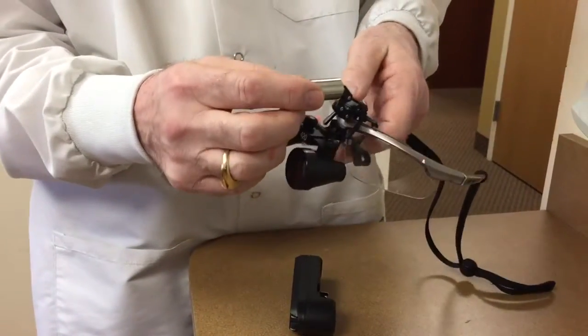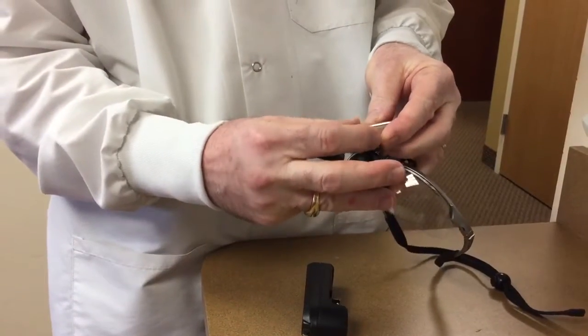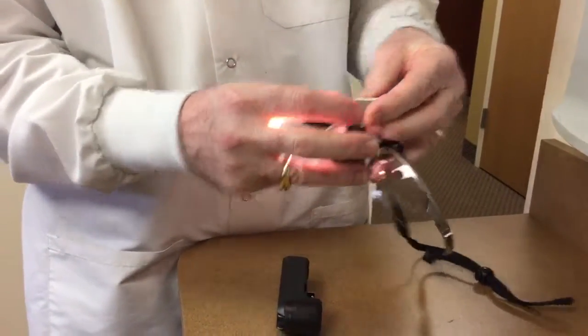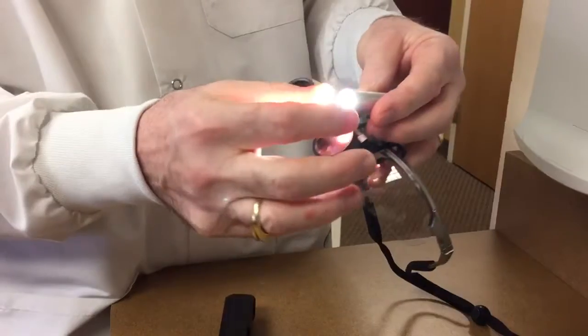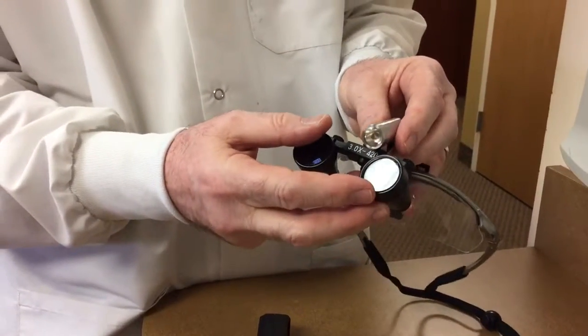Then in order to use the light, all you need to do is turn the lens clockwise and the light goes on. To turn it off, just turn it slightly counter-clockwise and the light goes off.